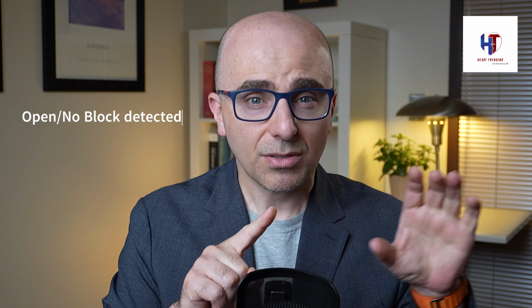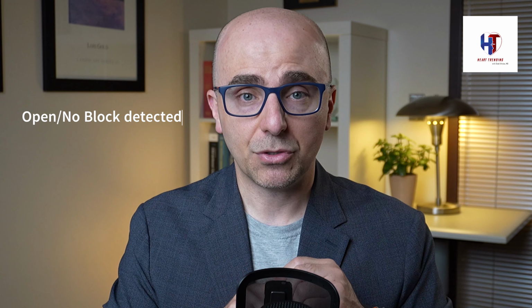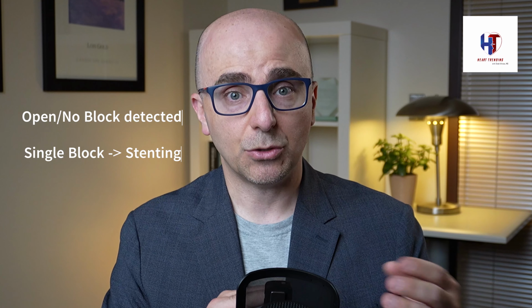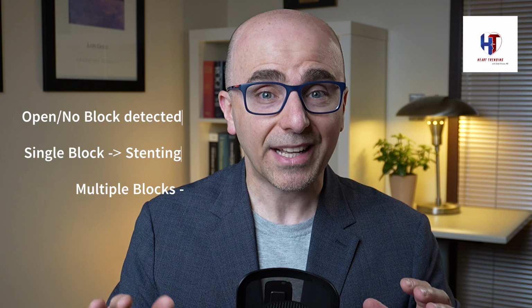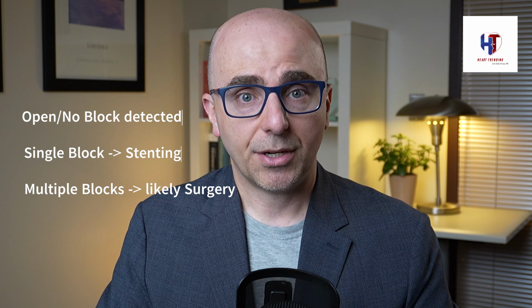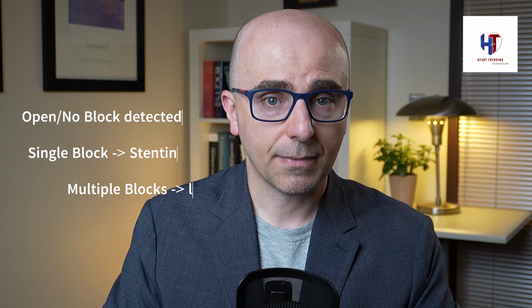So the finding of this angiogram can be one of three. One, either everything's open and there is no blockage in the artery, or some build-up but nothing significant enough to put a stent in. I will talk about the stent in future videos. Two, there is one blockage that can be fixed with a stent and it's favorable anatomy, then the proceduralist will proceed and put a stent in you. Three, there's too much blockage, or blockage in the main areas, the main supplier of the heart and the critical areas. At that point, the procedure will stop, we take you to the holding area, and then we'll ask our surgical colleagues to come and talk to you about possible open heart surgery.